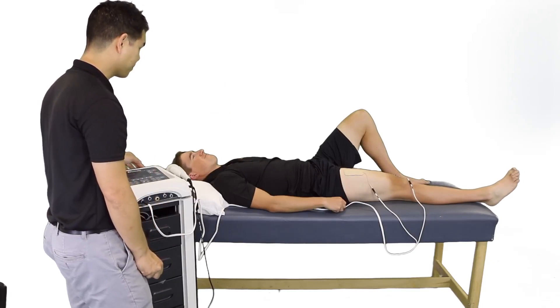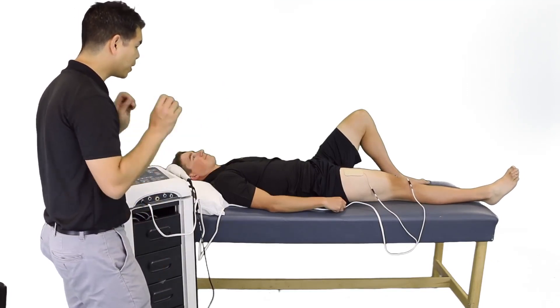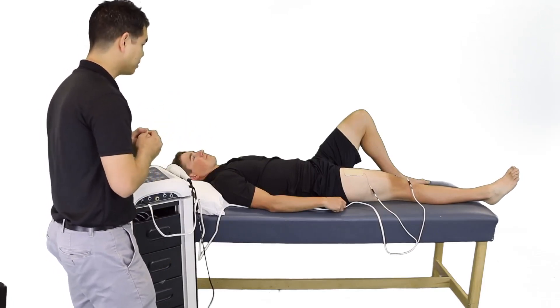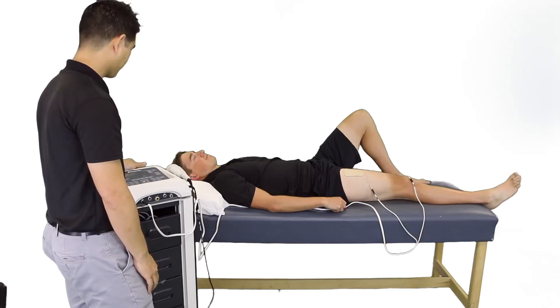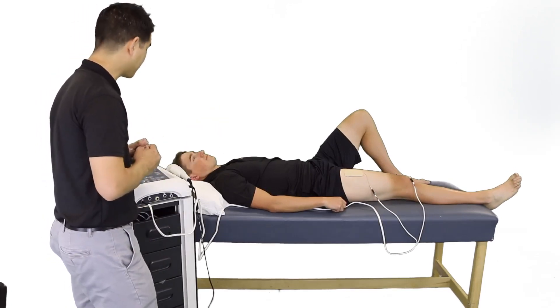I'm going to start the unit, and it is going to be on for 10 seconds. When it's on, I want you to activate your muscles, and then it will be off for 50 seconds where you can relax. We're going to be doing 10 repetitions of this over the next 10 minutes.